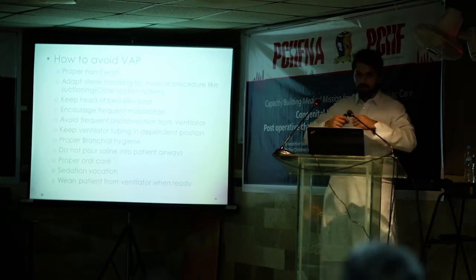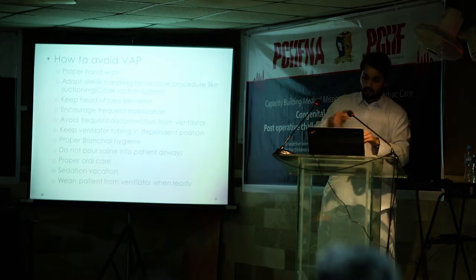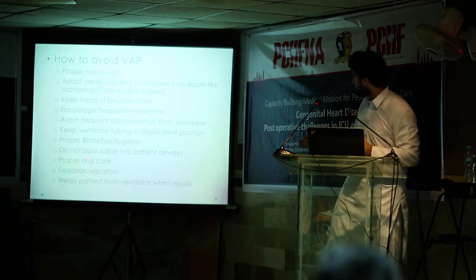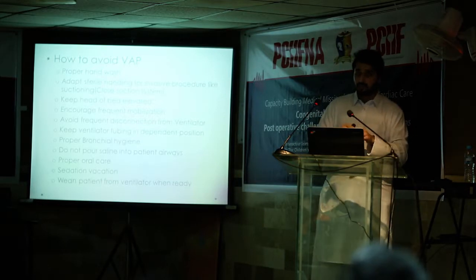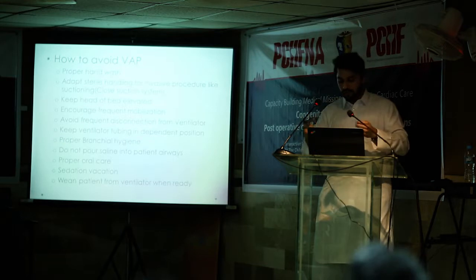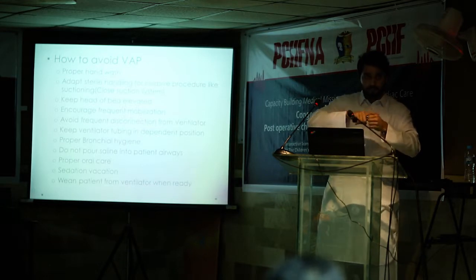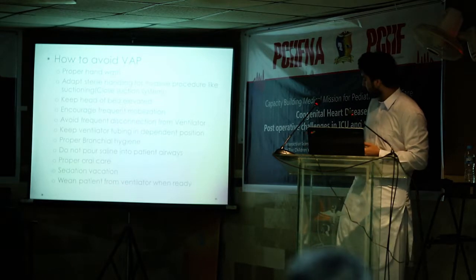Avoid frequent disconnection from the tube. Like, don't always disconnect to do suction. It's good if you have inline closed suction. That will help. It's here also, right? It's not here, okay. So inline closed suction is one of the best things also, because we will reduce the opening of the ET tube. You don't need to open the ET tube and do it with the suction catheter, no. Because opening the ET tube will expose the patient to the air, and air contains germs, so it could cause a VAP.